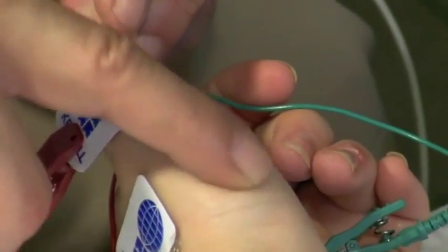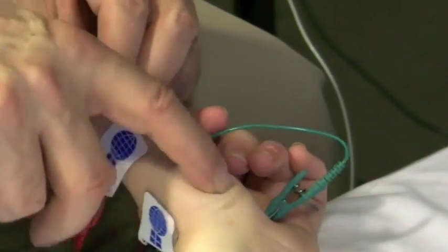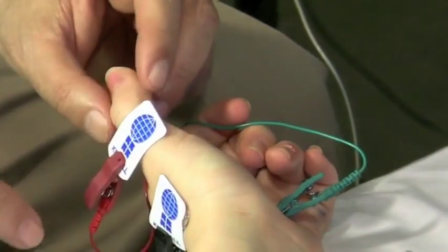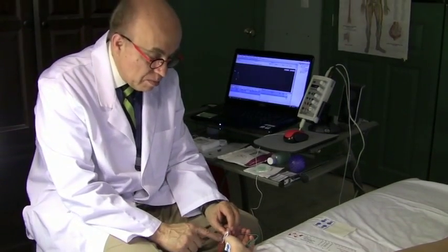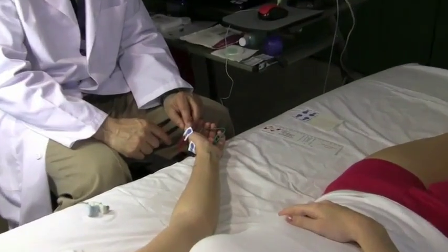The abductor pollicis brevis, the APB, is right here. It's really in the palm of the hand, right here. It's called the thenar eminence. Okay, so I need to locate the muscle first, obviously. So push your thumb against my hand to the ceiling.